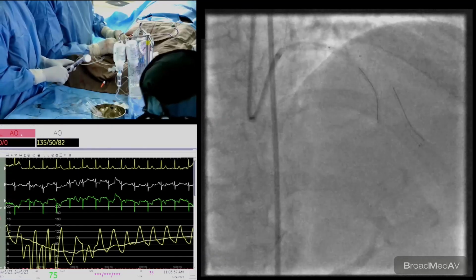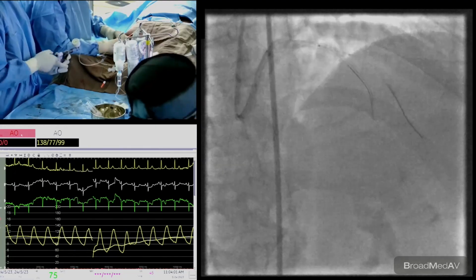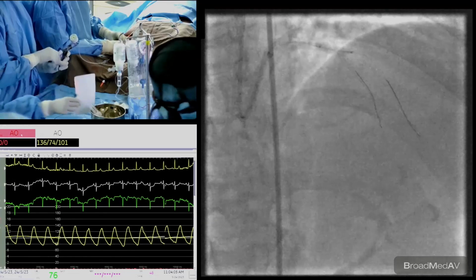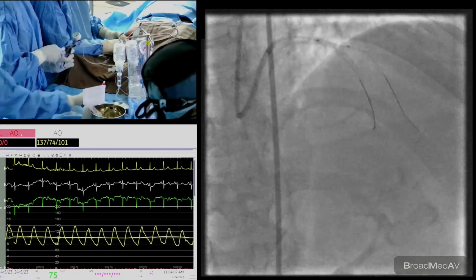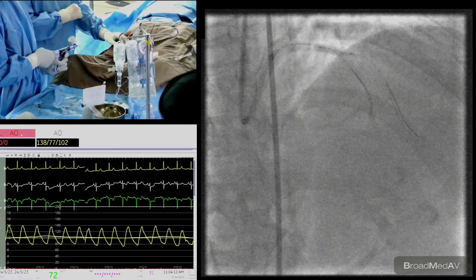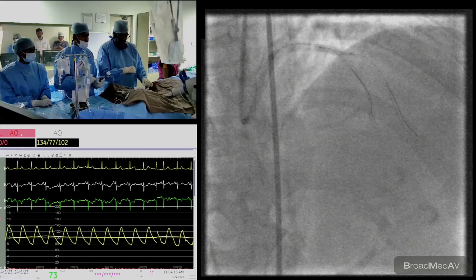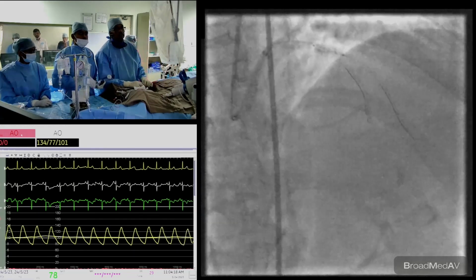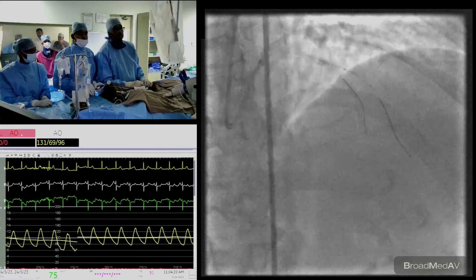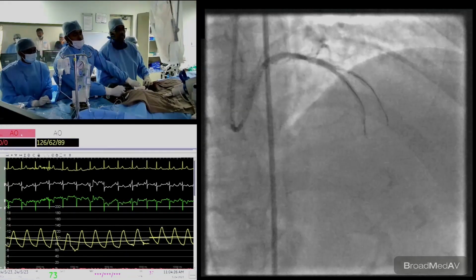Gently go up there. Go up, please. I think our pre-dilatation helped. Yes. It didn't open completely, the close struts. Just keep it at 6. Yeah. Keep it for some time to open the flaps, 5-10 seconds. Yeah, it's okay. We can deflate. Deflate, please. Now what I'm going to do is just push the deflated balloon down into the diagonal and check on the LAD.